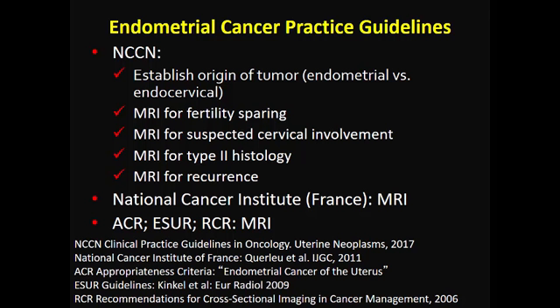Now, moving to the uterine malignancies, it's been a really long way, especially in the US, to try to get MRI accepted as one of the ways to evaluate extent of tumor in an endometrial cancer. I'm not using the word staging because it makes some of the clinicians a little bit too anxious if we say we can stage it with MRI, but actually we can.